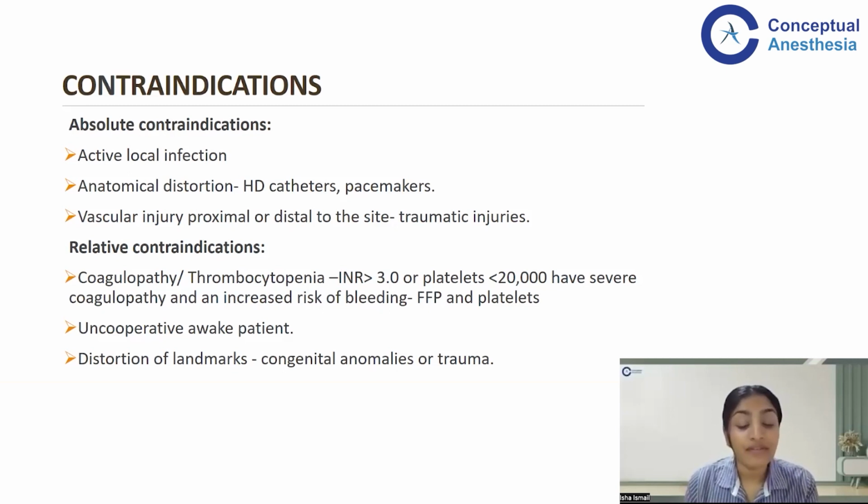Uncooperative patients who are awake will also be a problem when we are inserting because they can lead to mechanical complications like accidental arterial puncture, etc. And distortion of landmarks in patients with congenital anomalies or trauma can also pose difficulty in insertion of catheters.